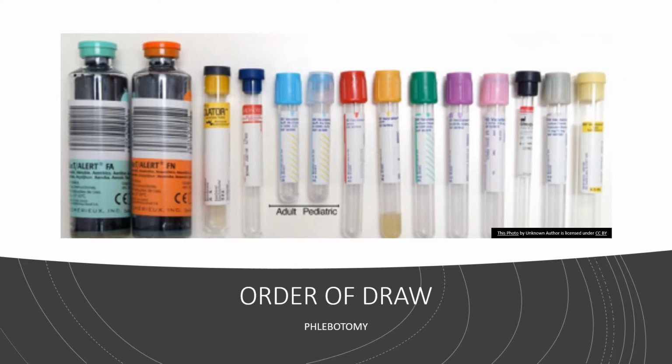Where you see that gel substance, which is an additive. Anything that's placed in the tube is an additive. And you'll see that gel concentrated down there at the bottom on that yellow tube that's right next to the red, in between the red and the green.